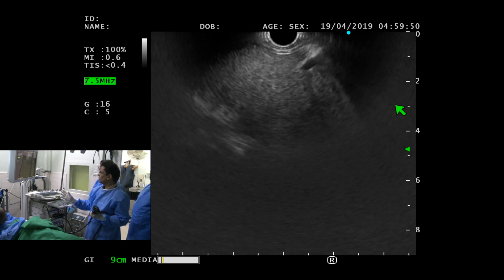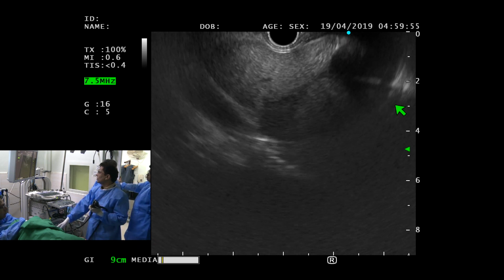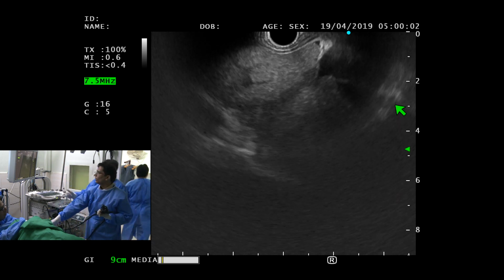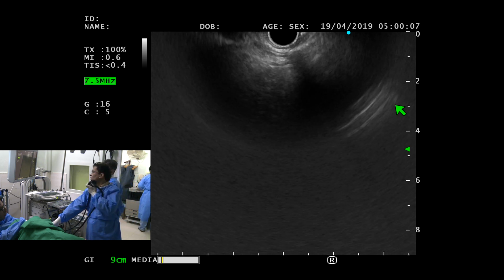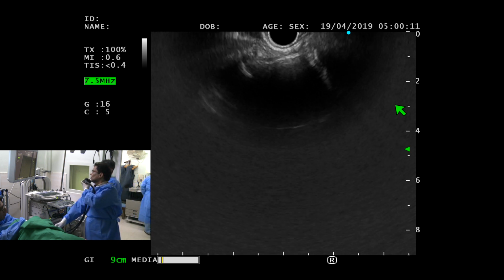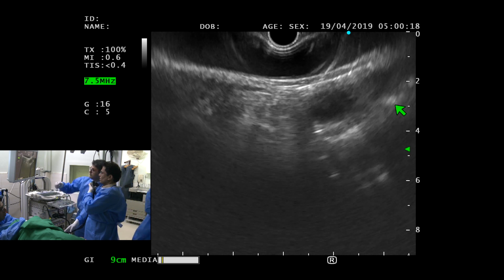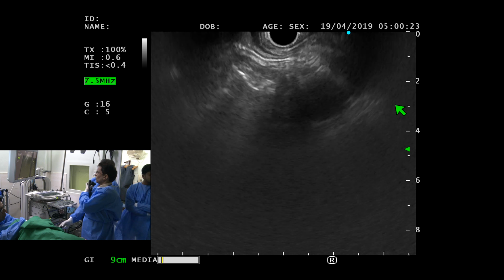So let's do that. So start to go clockwise. But you इसको support करना. You don't have to talk from the right hand anywhere. Okay, beautiful. At this stage, keeping aorta in the middle, you push in and show me the celiac takeoff.